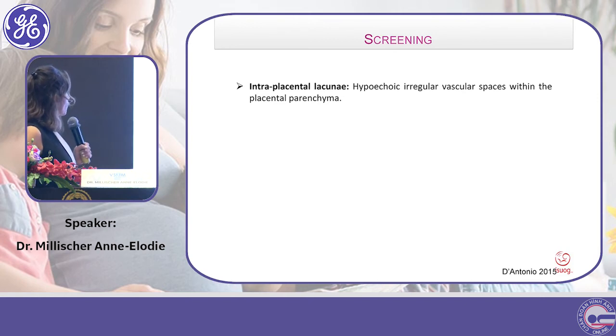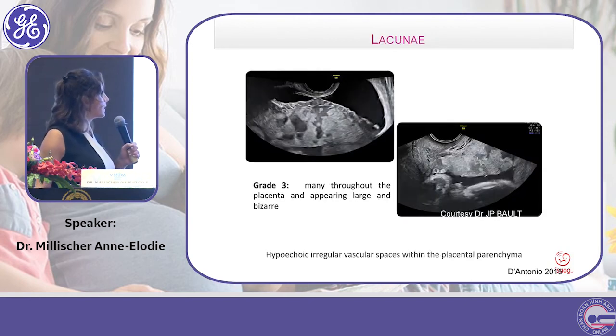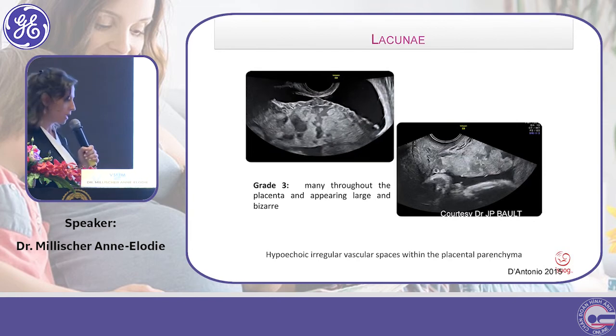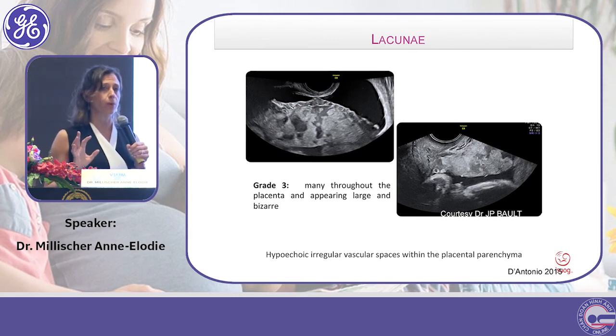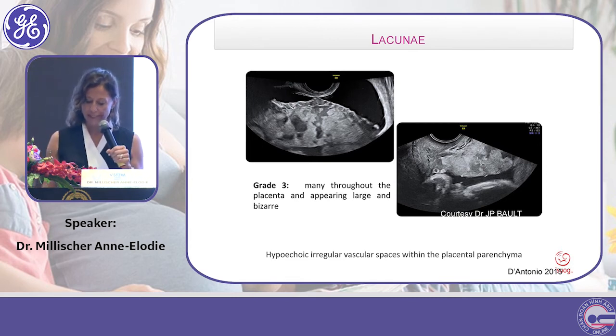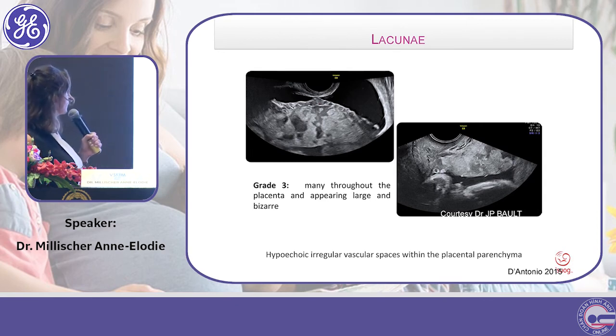Recently was published some FIGO consensus guidelines in order to correctly and systematically describe all the points to provide a precise diagnosis of placenta accreta. And you have the list here.